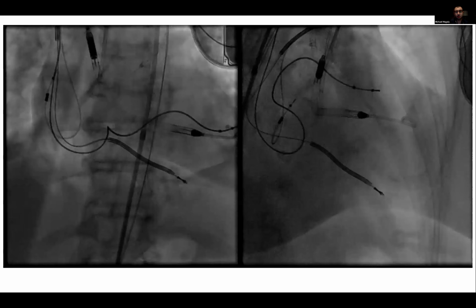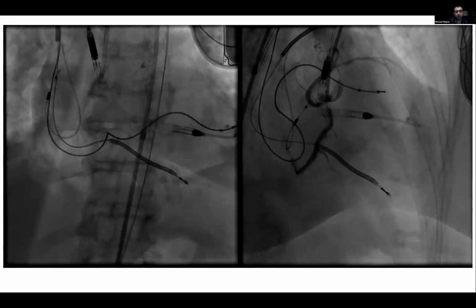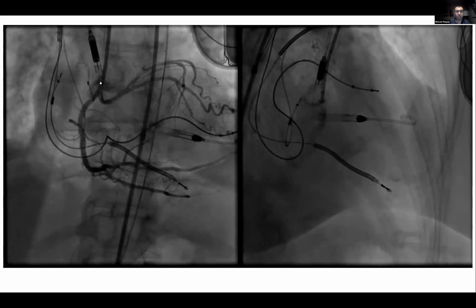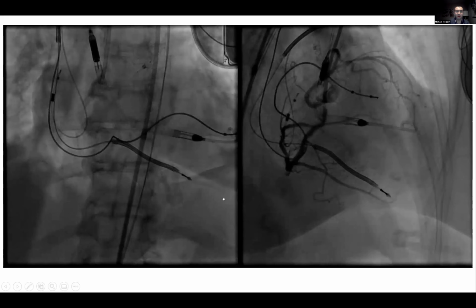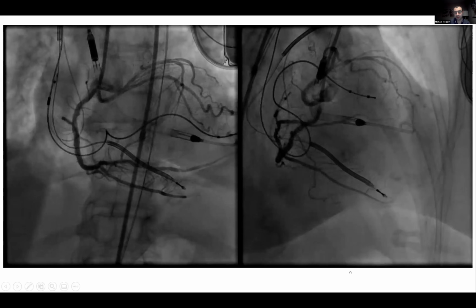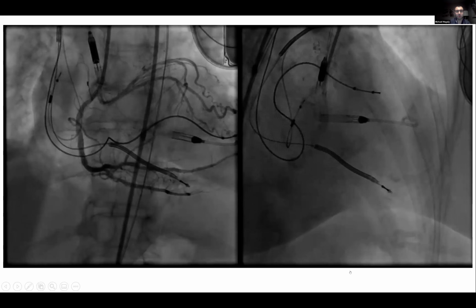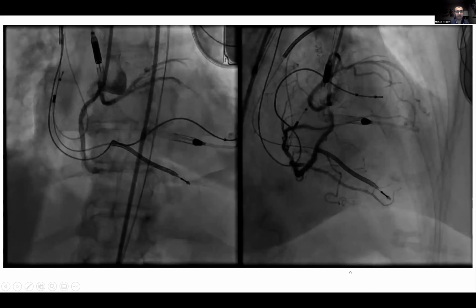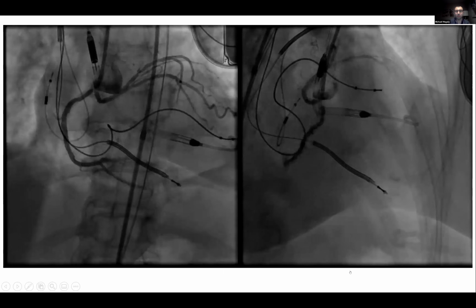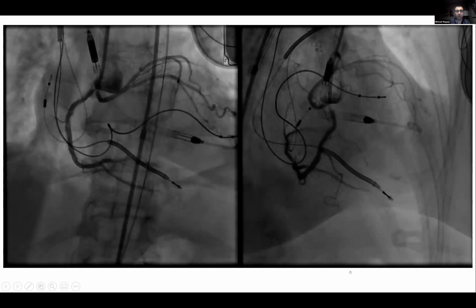And you see, these are her images. You see here severe calcification and a single ostia, pretty scary looking with calcification. As you already see in the images, we decided to go with an Impella CP support, given a low EF and high-risk anatomy, even without considering her hemodynamics.